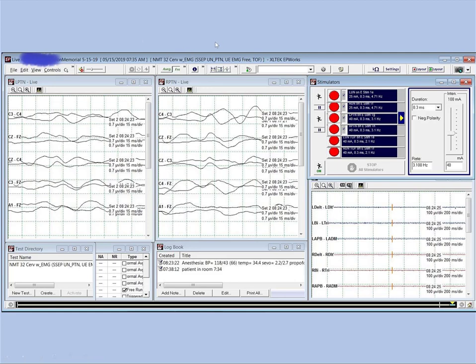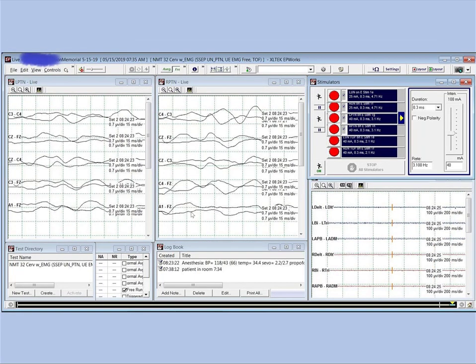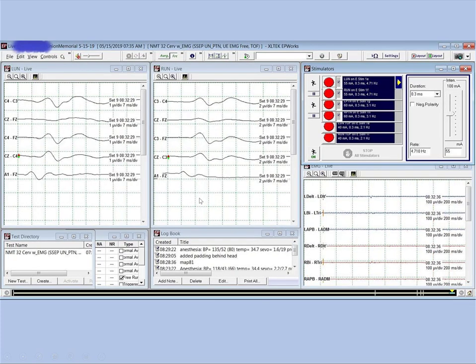So this is intraoperative findings. Basically, we positioned the patient, put her to sleep, and I went out to wash my hands. It was during the time that I was washing my hands that the neuromonitoring started to go out. Basically, the left arm went out, and then both legs went out. And she should have a peak and trough that's similar to this, and it was basically flatline, first in the left arm, then both legs.